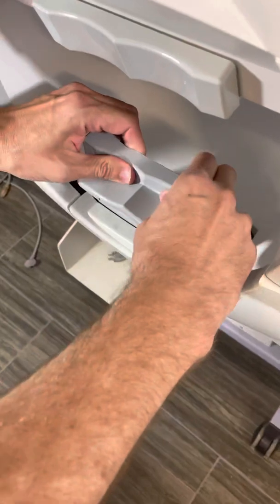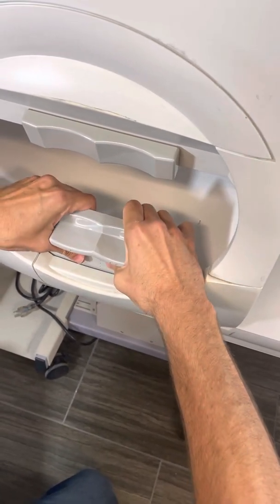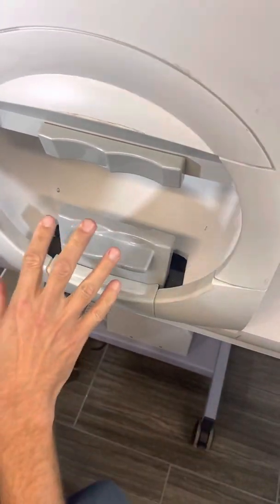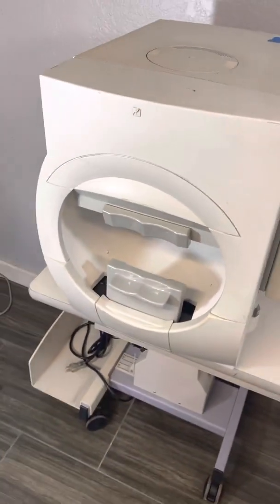Now squeeze all the way around and hold it real tight. Then let this sit overnight to let the adhesive cure. Make sure that metal goes all the way up to the top and the back. And that's it.